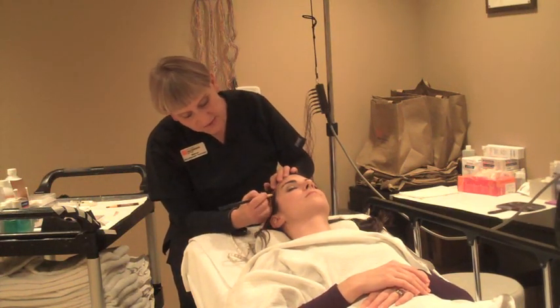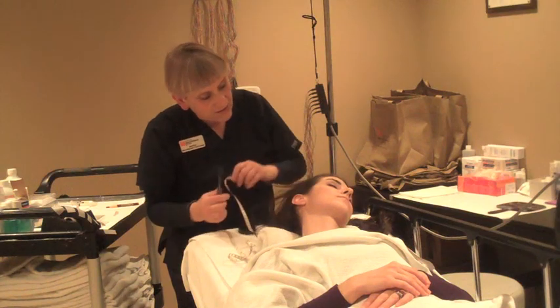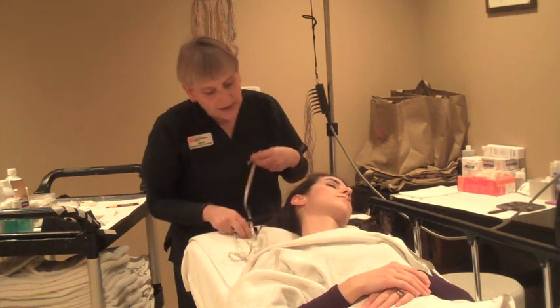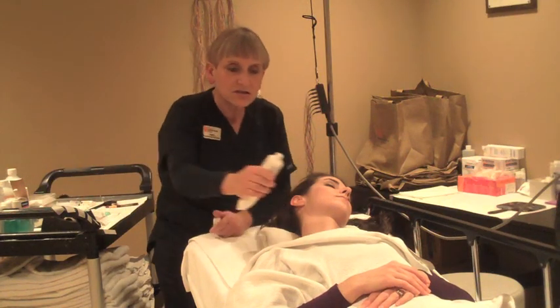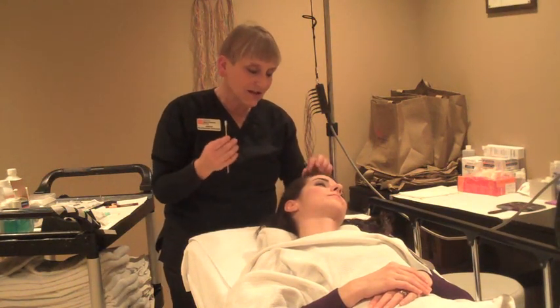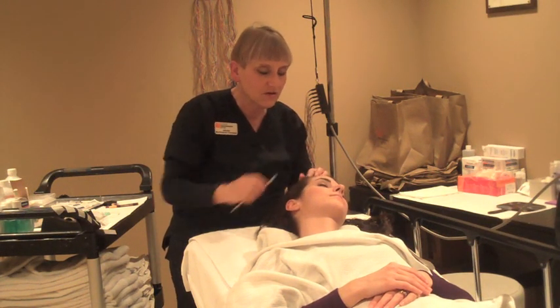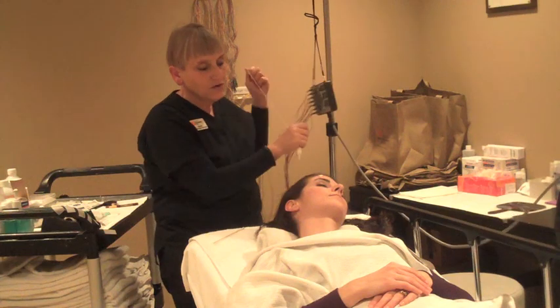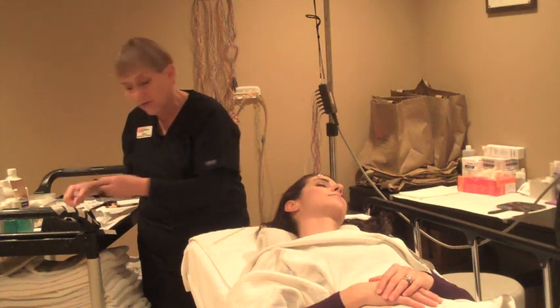Once we have all the measurements made, we're going to turn your head a little bit and place the electrodes on, first with a little cleaning solution. Then I'm going to put a little electro paste on — it's a bit like toothpaste, it actually comes in a tube. This is just a cleaner on a Q-tip with a little bit of grit, like liquid sandpaper, which gets a little bit of oil off your skin right where the wires are going to go. There will be a total of 27 electrodes on your head, and one on your left hand to record your heart rhythm, since the heart rhythm is a very large rhythm and can sometimes be seen in the brain as well, so we monitor that.